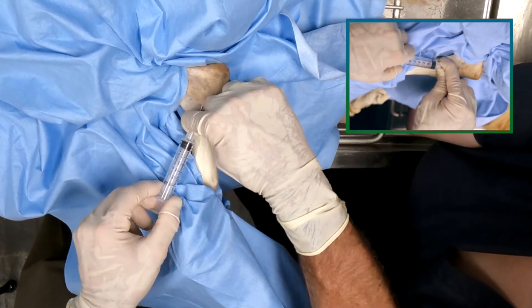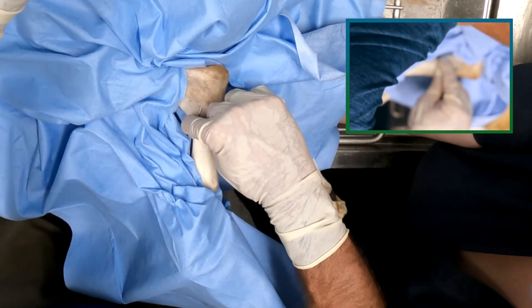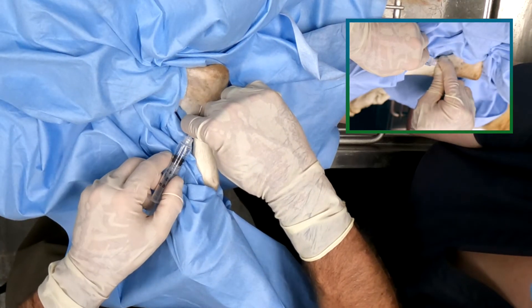This is a very shallow joint. Consider holding the needle in place for your aspiration and injection.